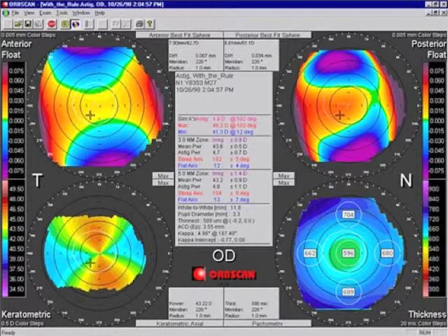Now let's ignore the periphery of this cornea here, because once more we have to factor in the peripheral flattening of the cornea that occurs near the limbus. Let's just look in the center and paraxially in this cornea. And what do we see? We see our can of Schweppes bitter lemon lying at axis about 10.